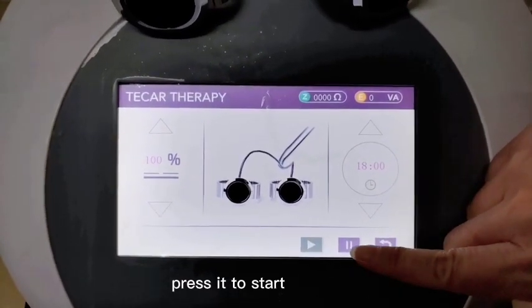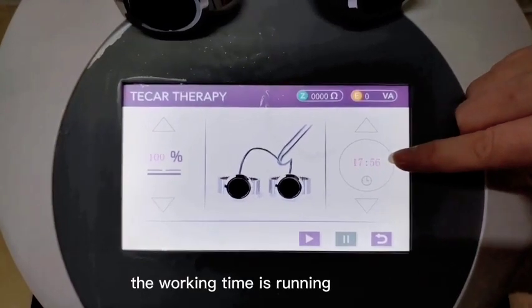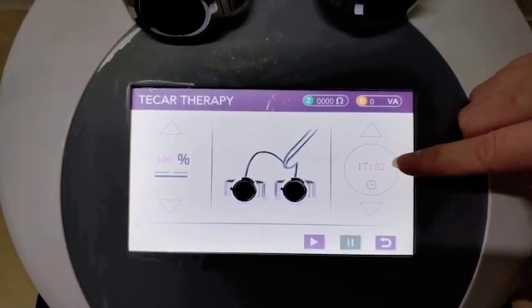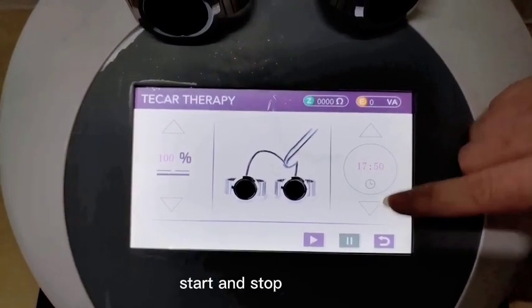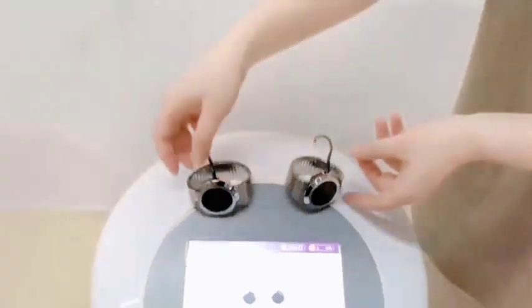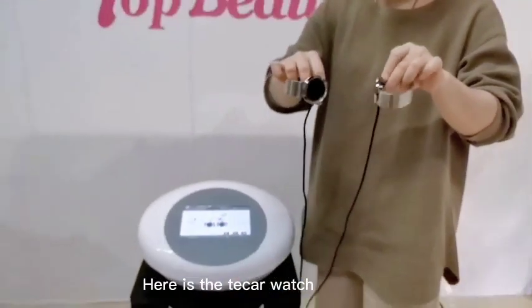And this one is the start/stop button. Now it's working — the working time is running, which means it has started working. I will show you the two watches.